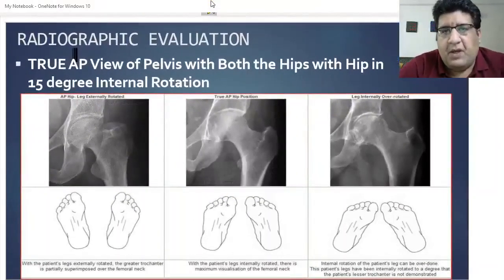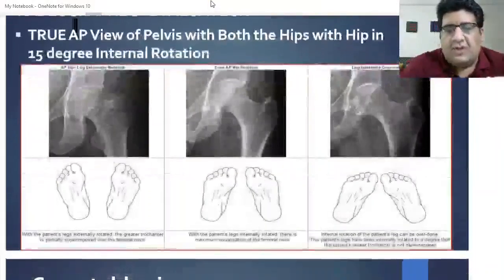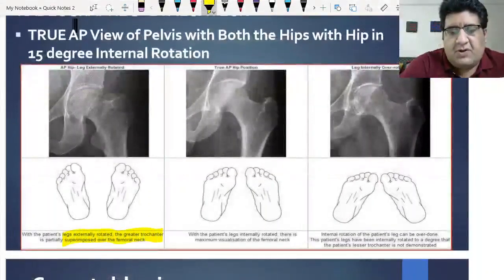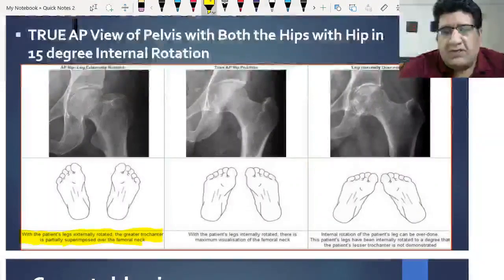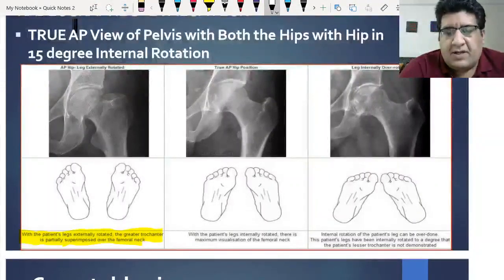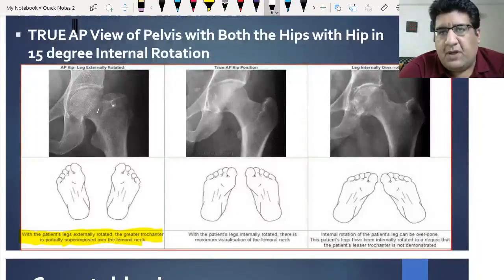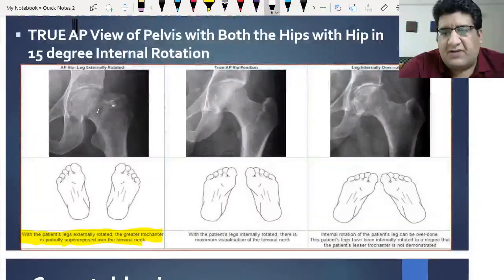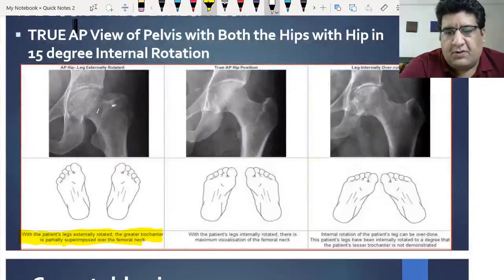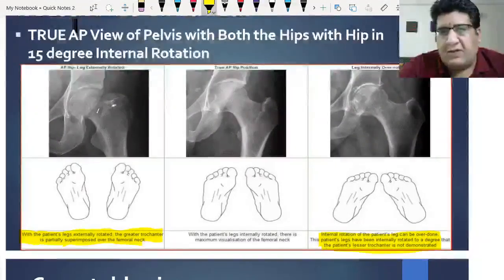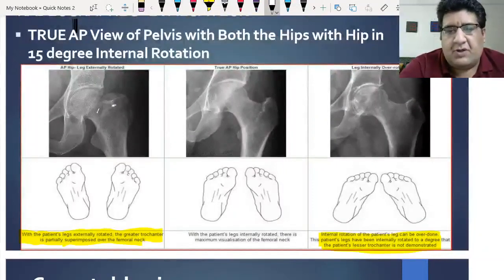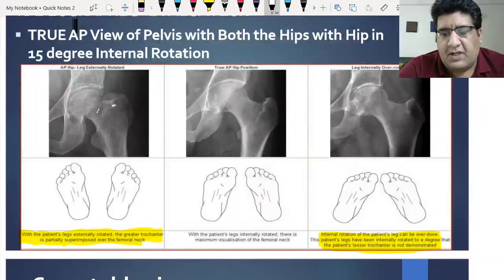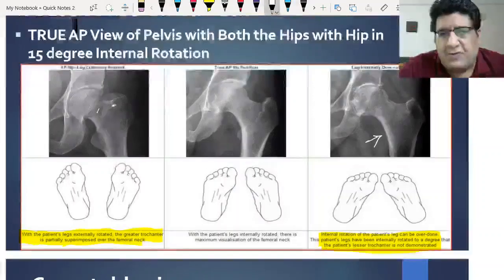It is important to note: if you put the legs of the patient into external rotation, the neck is superimposed by the greater trochanter, which you can appreciate on the image. And if you put the legs into excessive internal rotation, the whole structure rotates posteriorly to such an extent that the lesser trochanter will not even be visible.